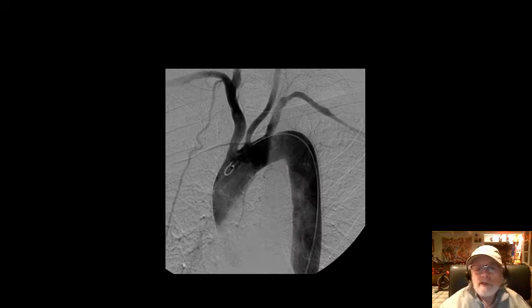This is another one. This is digitally subtracted. And on this one I actually see things possibly even a little bit better. You see how it looks like the ribs are a very faint shadow in the back? By doing multiple images, they're able to digitally subtract, by an algorithm, the vast majority of what you see of the ribs. This way they just see the aorta, just like doing a Photoshop, taking away the stuff that you don't want to see and leaving the stuff that you want to see.